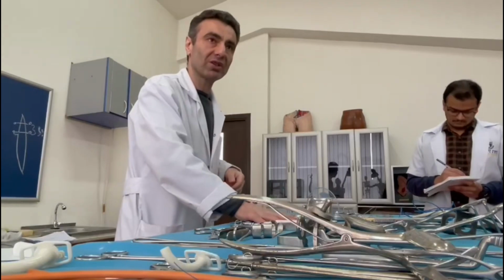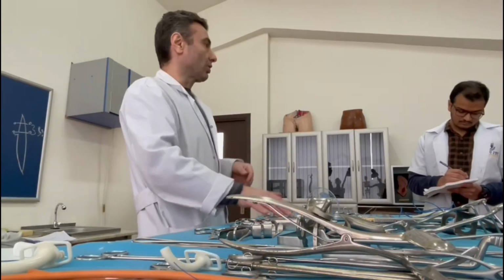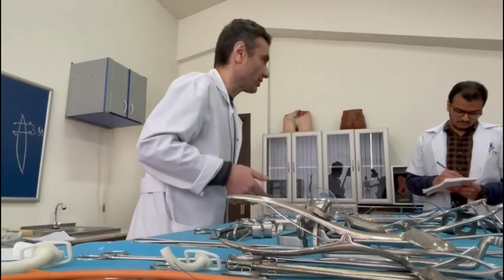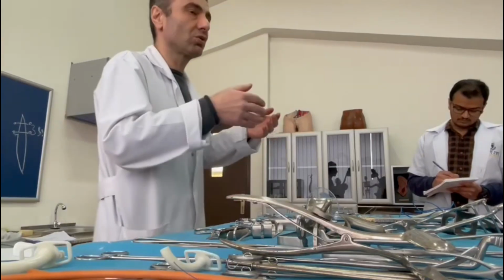Group number 2 of surgical instruments is the instruments to arrest the bleeding. In another way, we call them hemostatic surgical instruments. Which instruments do we have here? That is the instrument which is used to arrest the bleeding.